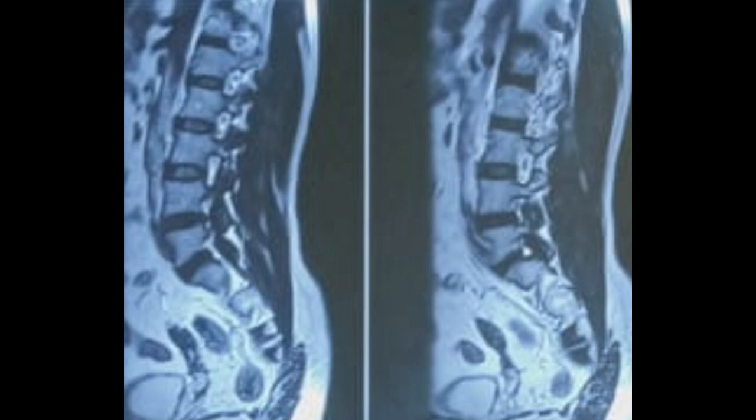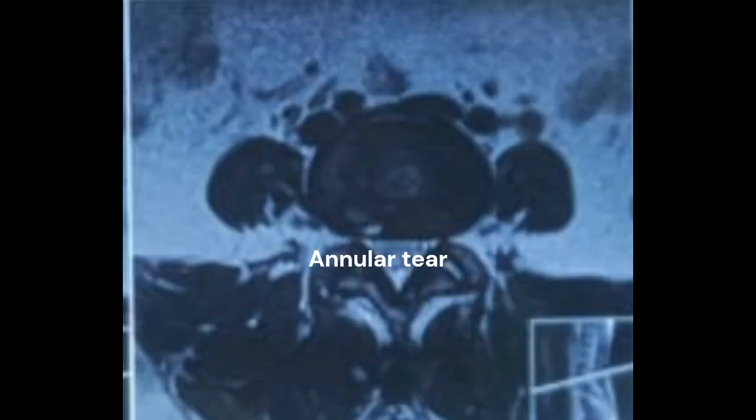The MRI shows a prolapsed intervertebral disc at L4-5 with an evident annular tear. Sagittal sections show significant stenosis of a region called the lateral recess and foramen. Axial sections confirm the same.